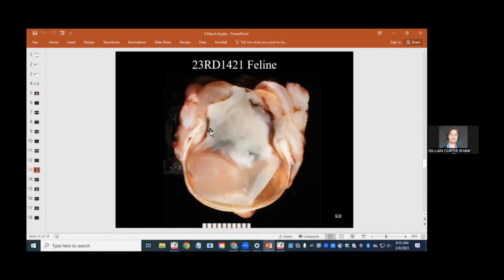And there's just no cornea. This is limbus and sclera, and this is limbus and sclera, and there's a tiny nubbin of cornea here, and that's it. This up here is third eyelid that we have in cross section. So the cornea is just gone. The iris is completely prolapsed through that space where the cornea used to live.